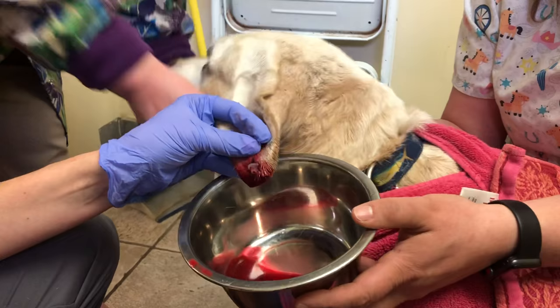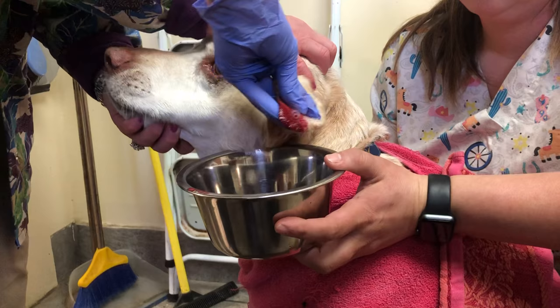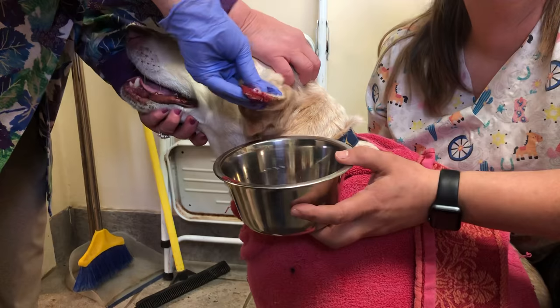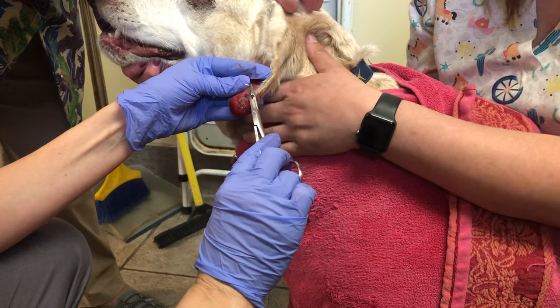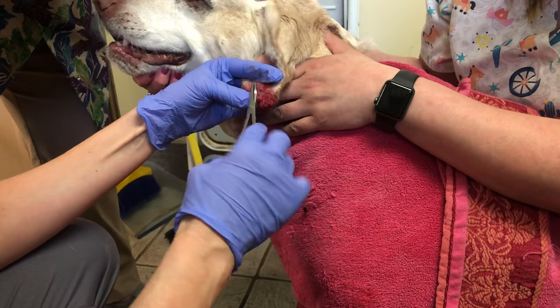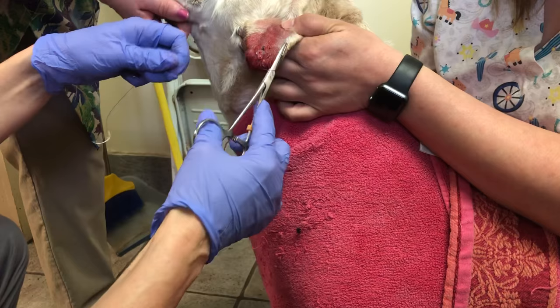The next thing to do is put some sutures in to hold it. I'm using a suture to hold the cannula in, and I put a suture on both sides of the pinna where the drain is to lock it in place. Then I knot it, and usually I also secure it with a little drop of glue.